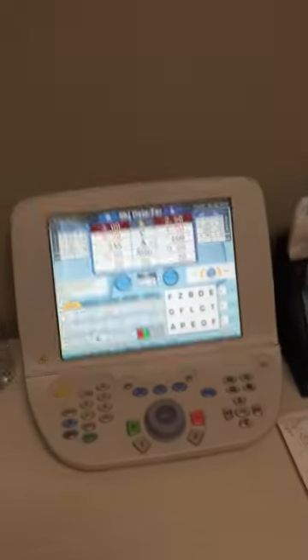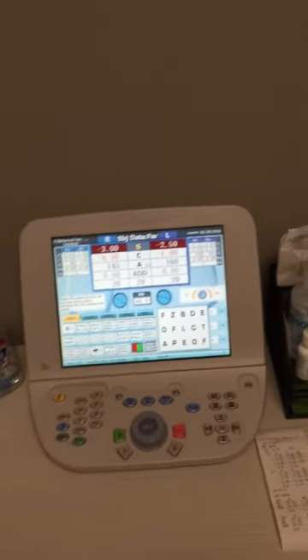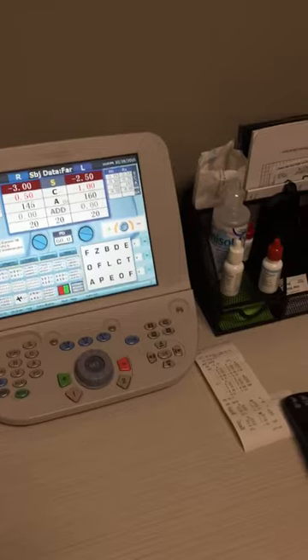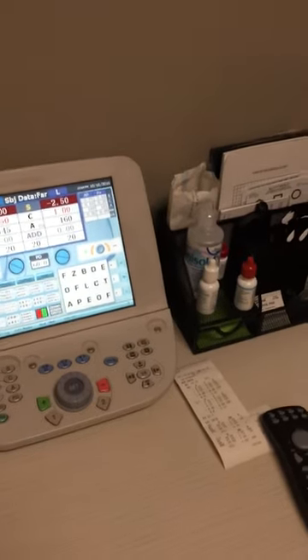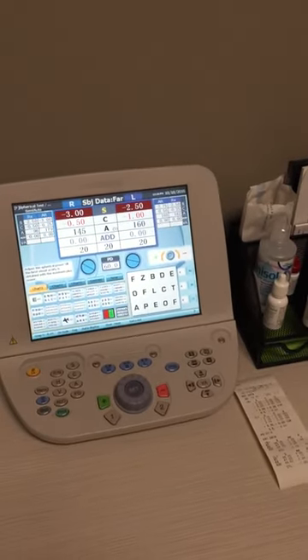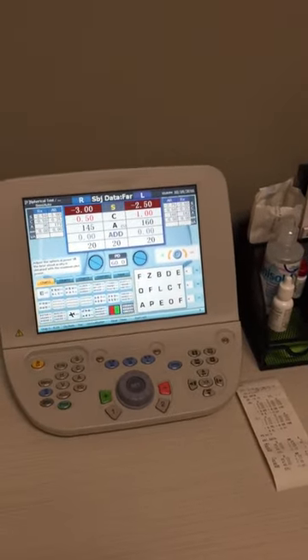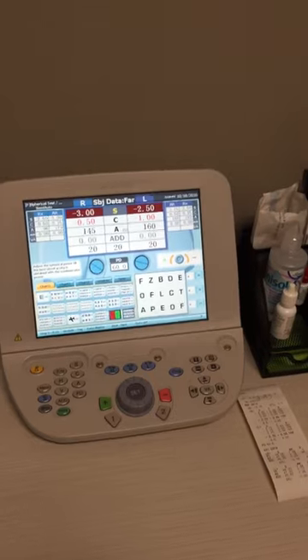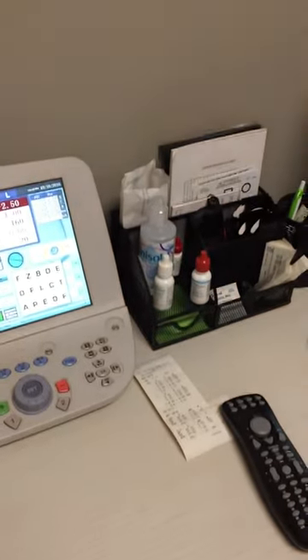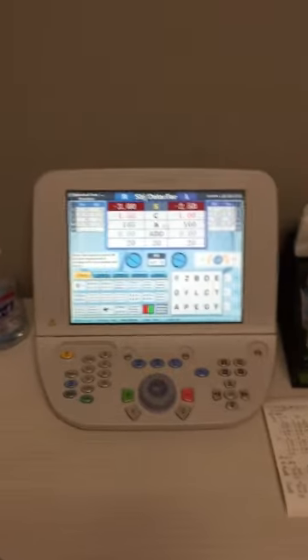Hopefully this little tutorial helped you out as far as using the Topcon Autophoropter and using it in conjunction with the auto refractor, the auto lensometer, and transferring it over to our software Revolution. Thanks, bye.